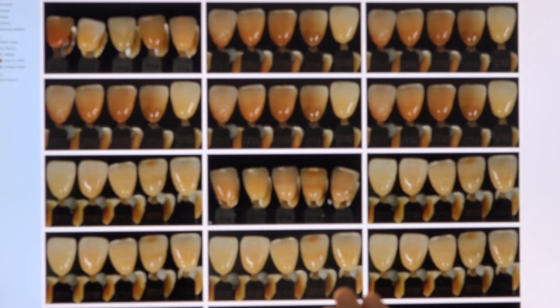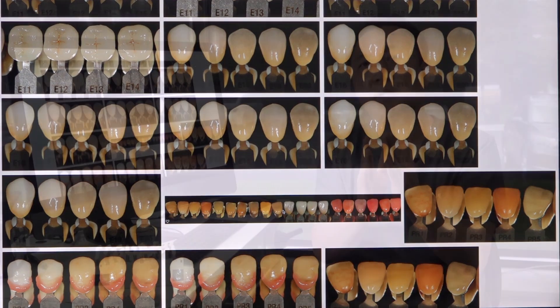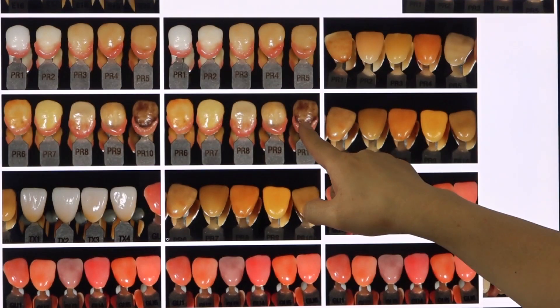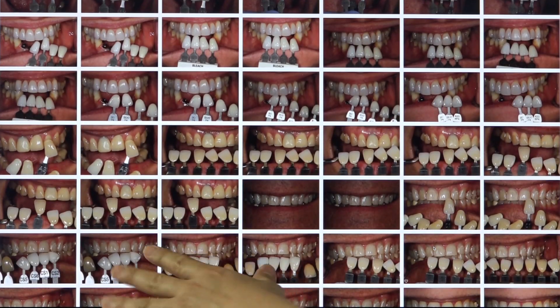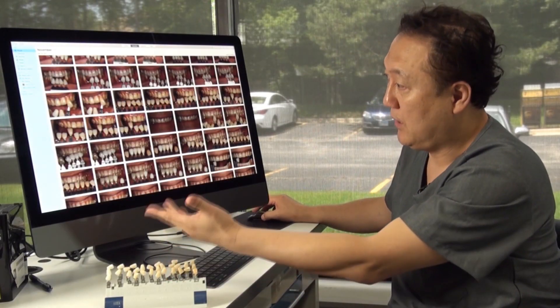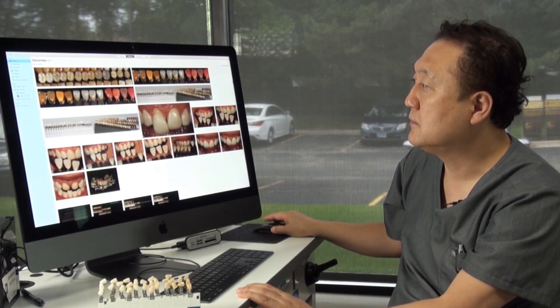I narrowed down 80 porcelains and fabricated it, put in the number. You have to make the good, proper contour and shape. You need the thickness, and then you can apply the porcelain recipe. This is my effort — I indicated dark and light. This changes everything, especially for veneers. The color testing with different patients — translucency, color — I tested with my own ceramic shade tab, with the discoloration and coloring. Here's the shade tab I indicated. That's why I can fabricate it like this.